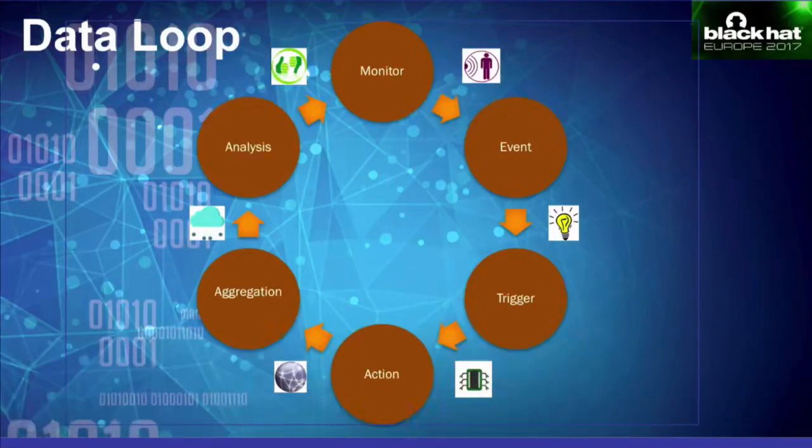After that is done, that data is aggregated, so it could be sent to a hospital's private network over VPN, sent to a cloud infrastructure, or simply stored on the device. This data aggregation part, and the next step, data analysis, are among the most important parts, at least they're going to be more important in the near future. The analyzed data could be consumed by security researchers, device manufacturers, medical practitioners, and general practitioners as well.